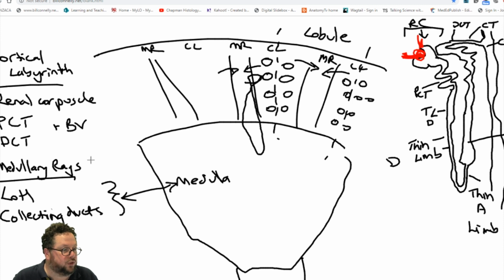University of Mississippi has a beautiful resin kidney section on their virtual microscopy database. I'm sure they do, however, I don't have permission from the people to actually use it in a live stream, so I can't go to that slide and use it. I'm sorry.